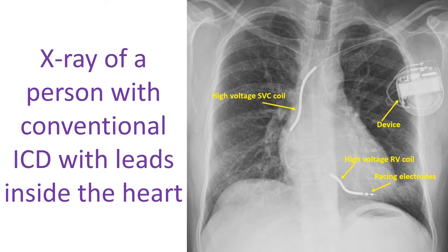It was for this reason that an ICD without a lead introduced into the heart was developed as a purely subcutaneous ICD. As the shock is delivered outside the heart under the skin, it requires higher power output to be effective. Hence, the device is bulkier to include a more powerful battery. This also reduces the battery longevity as the energy needed for each shock is more.